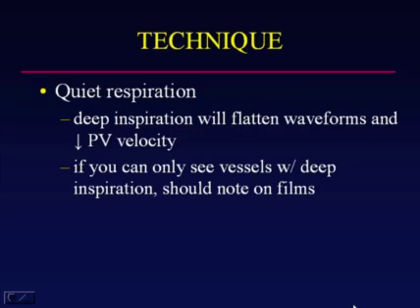It's also important that you do your Doppler examination while the patient is in quiet respiration. And the reason for this is that if you ask the patient to take a deep breath, which you often do so that they will push the liver lower into the abdomen below the ribs so it is easier to look at, changes will occur in the portal vein.